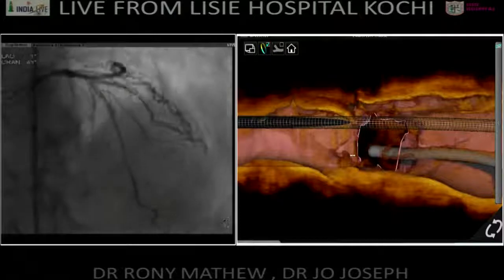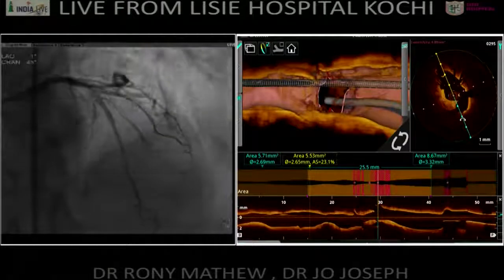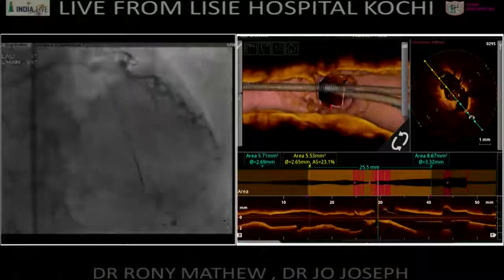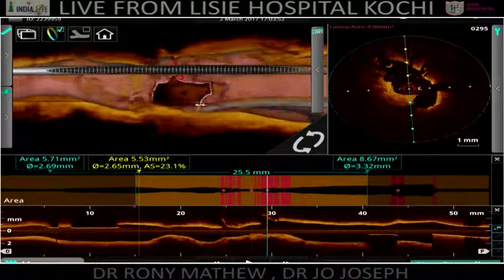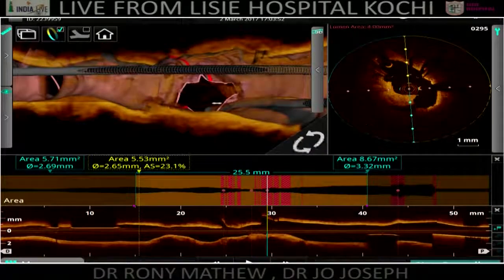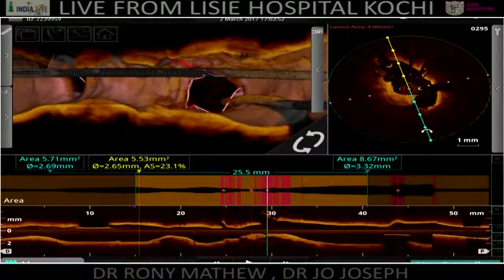Get out from the full view. And now can you rotate that so that you can give us a better view of that? Rotate it a little more at 6 o'clock, and angulate it. I hope you can see very clearly that we are going through the proximal strut. Now in case we were not, we would probably rewire that. So I'm at this point right now.